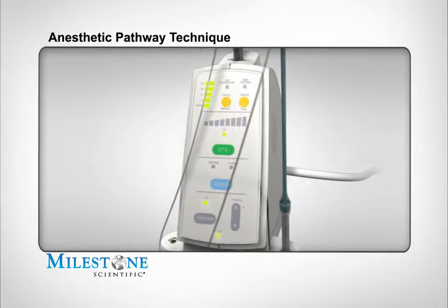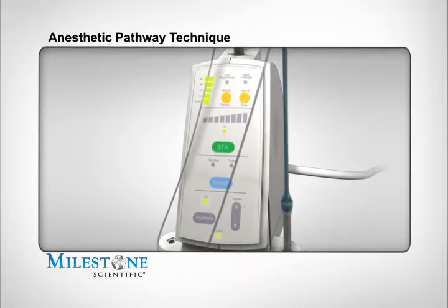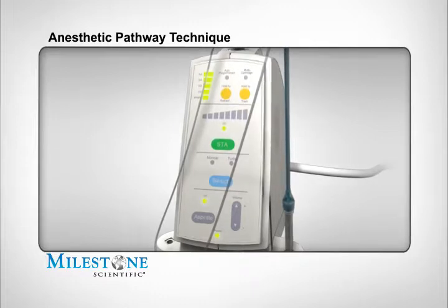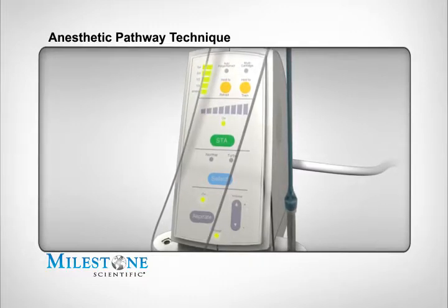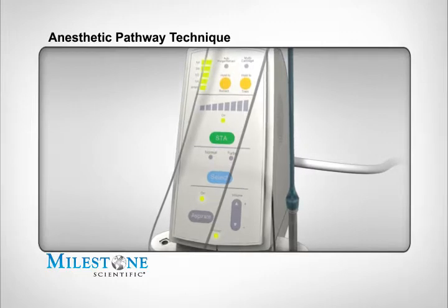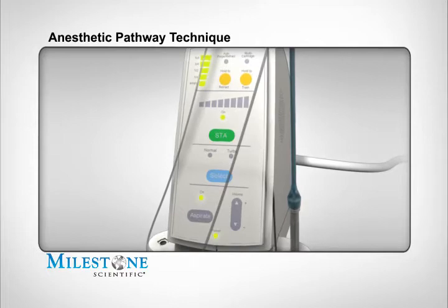By making your office syringe-free and exclusively using the wand STA system in your practice, you will observe numerous benefits which include increased referrals, improved treatment acceptance, stronger patient loyalty, and generally happier patients. But most of all, you and your patients will know that you're providing the highest level of care by integrating the world's most advanced dental injection technology that is available today.